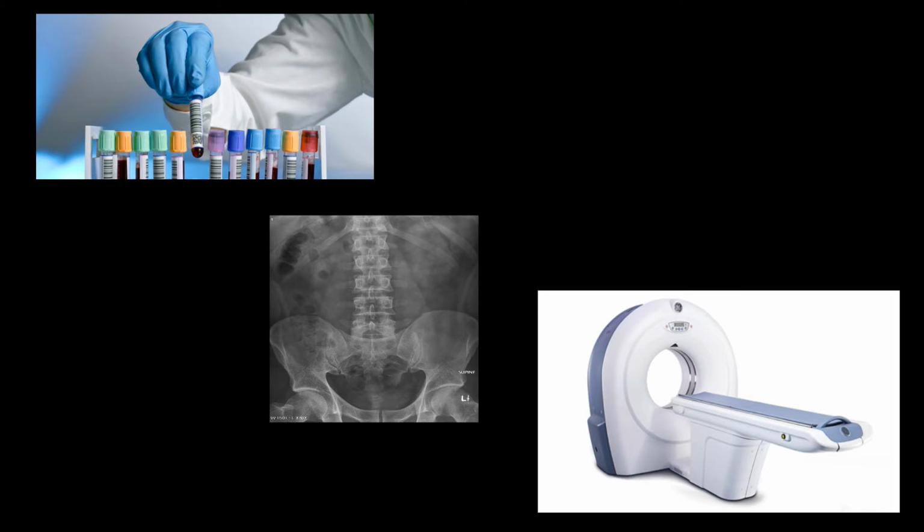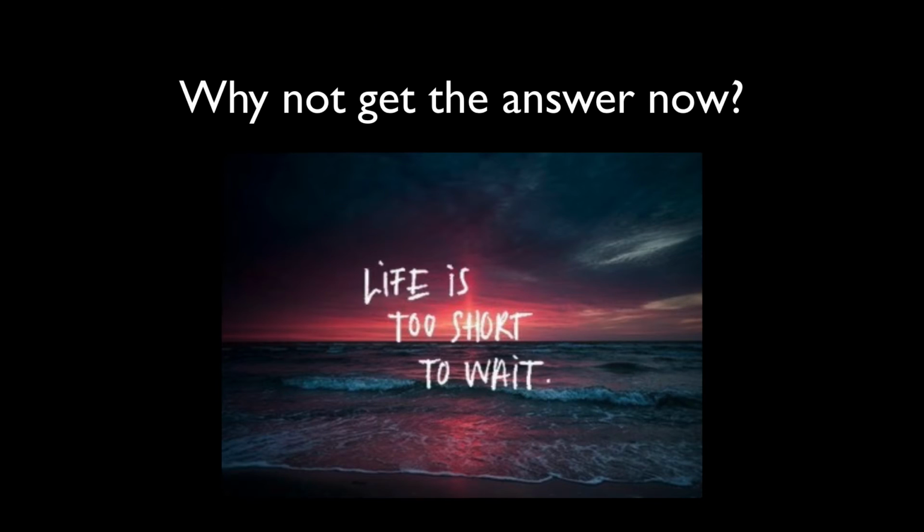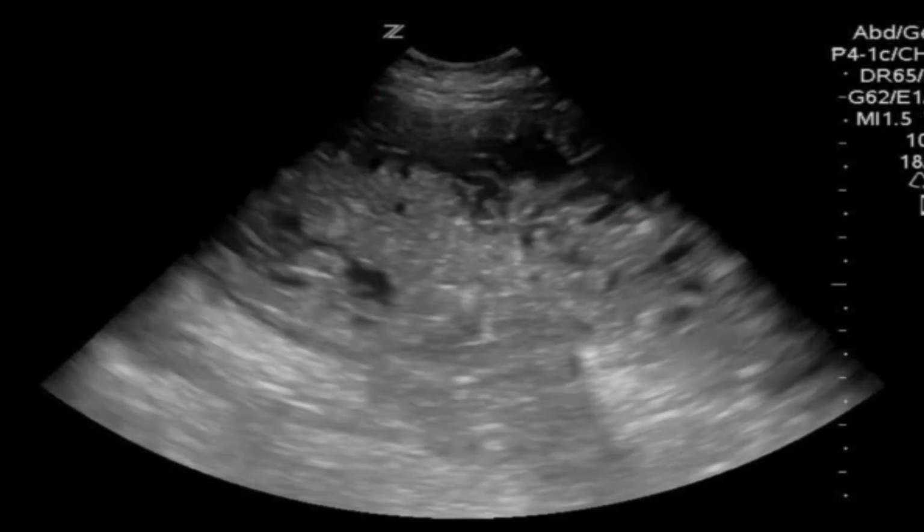You call radiology because you're concerned about an obstruction, and they want you to use oral contrast. There's about 8 or 9 people ahead of your patient. And it turns out he's suffered some acute kidney injury or possibly just has chronic kidney disease. So you bring in the ultrasound, and this is what you see.